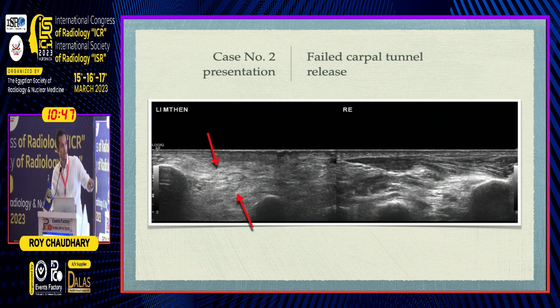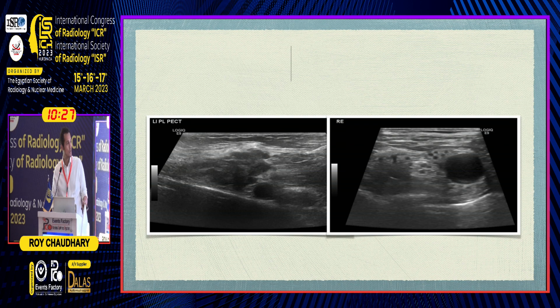They're echogenic and they're atrophied compared to the right side, where we can see just on top of the flexor pollicis longus, the muscle is preserved, and even below it's relatively preserved compared to the left side. So when you're seeing that, you're immediately thinking that it's a mixed nerve pathology, right? Because if it was just the median nerve, you would just see the superficial muscles being affected. So whenever you see mixed nerve pathologies, go hunting for proximal lesions.